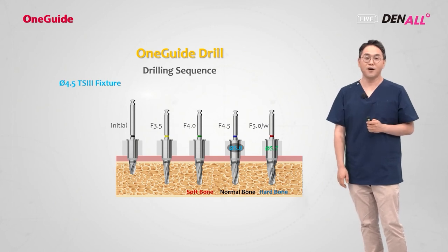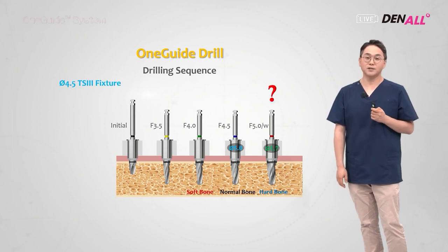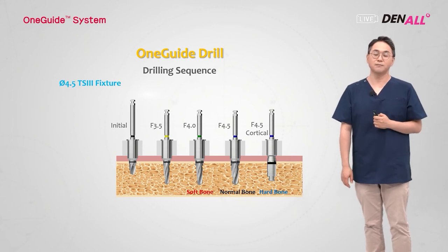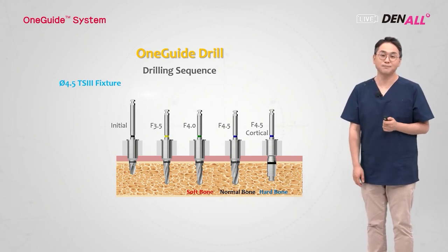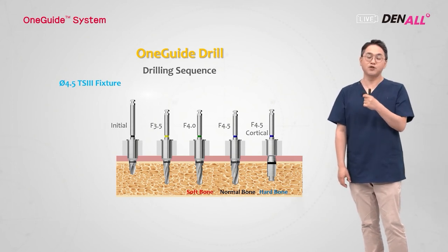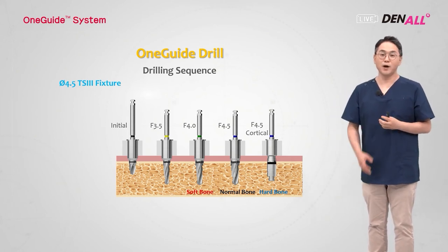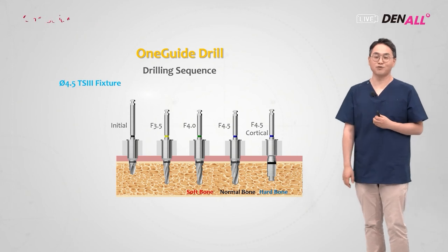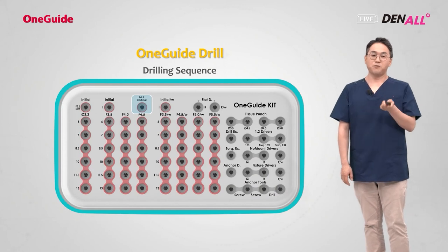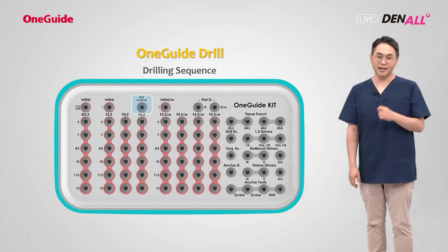The 5.0 diameter one guide drill cannot be used, so for such case, a taper cortical drill is included only for 4.5 implant placement. Once again, in placing a 4.5 millimeter diameter implant, one size bigger drilling cannot be done, so a cortical drill is there for the 4.5 diameter implant. So some doctors ask why we don't have cortical drills for 3.5 and 4.0. So I'm explaining. It is there. The F4.5 cortical drill is used to place a 4.5 implant in hard bone.